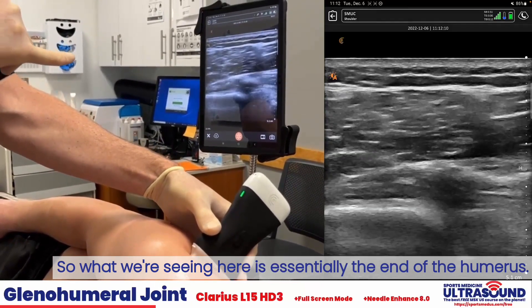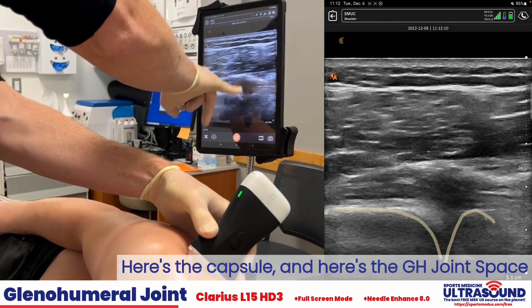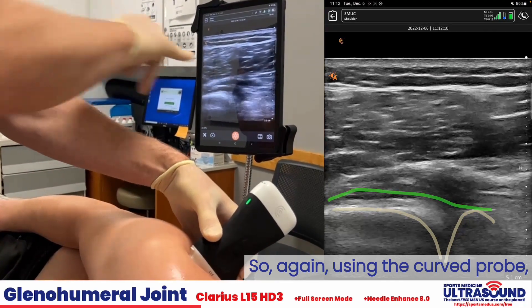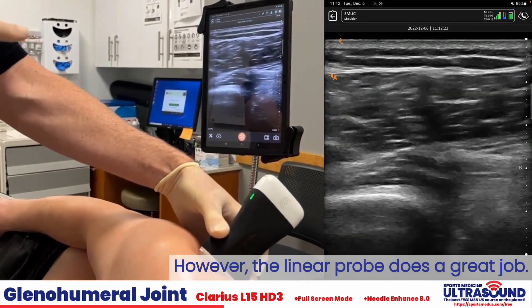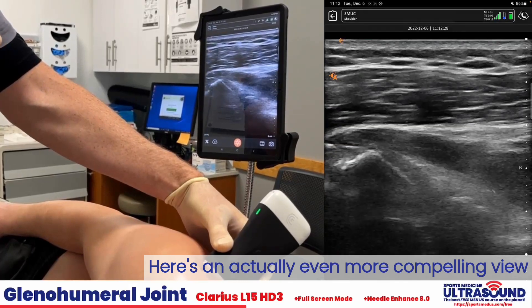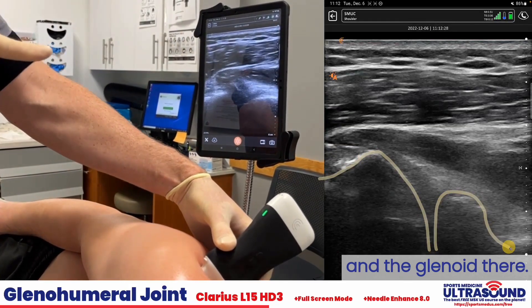What we're seeing here is essentially the end of the humerus. Here's the capsule and here is the glenohumeral joint space. Using the curved probe will get a better view, however the linear probe does a great job. Here's an actually even more compelling view of the medial edge of the humerus and the glenoid there.